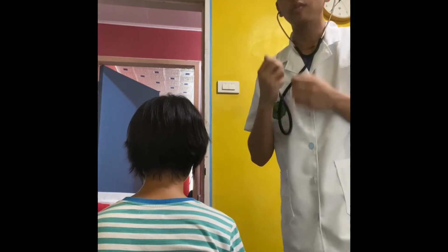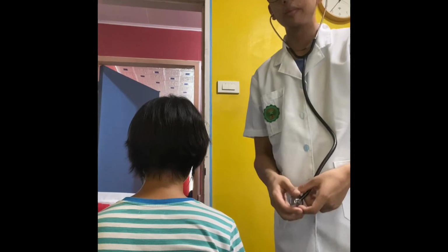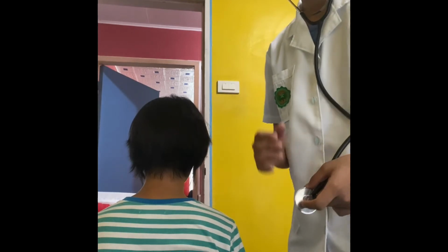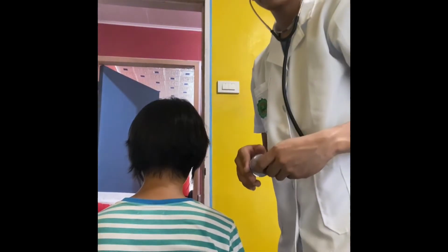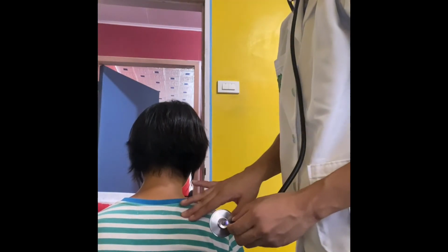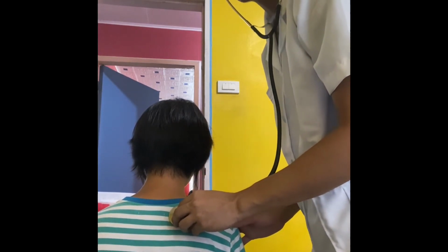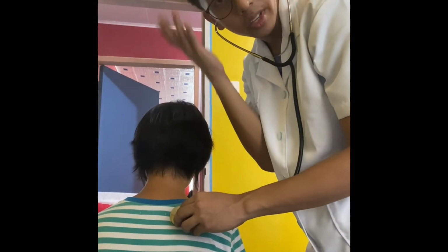So now we're going to be auscultating the posterior chest, right? So same concepts apply. We need to listen for the breath sounds during inhalation and exhalation, right? So I'm going to be auscultating the first landmark, which is medial to the superior angle. So this is the superior angle, so I'm going to go medially. So inhale, exhale, miss. So I'm assessing the apicoposterior segment and the right apical segment of the upper lobe.